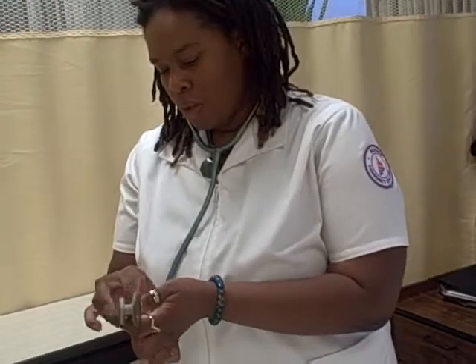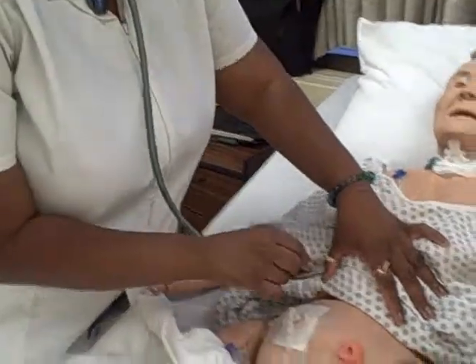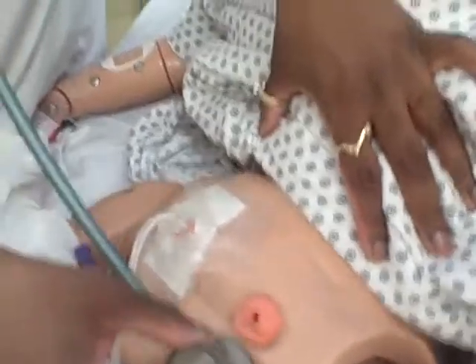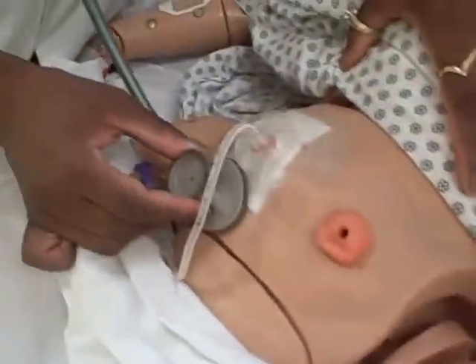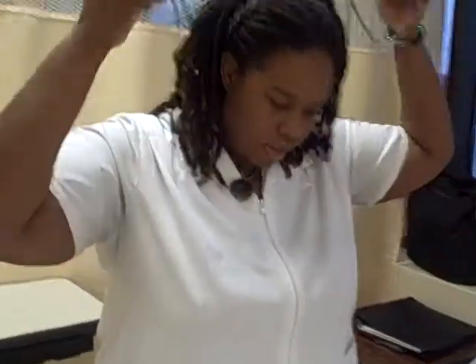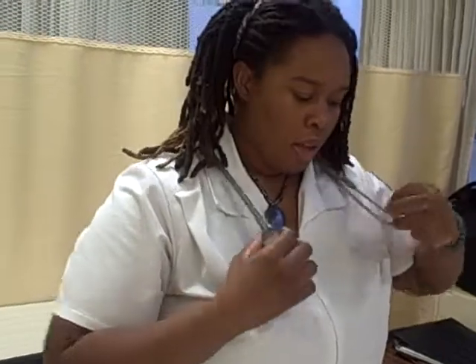So with an alcohol swab, I will clean the diaphragm and let it dry, and then auscultate the 4 quadrants. Okay, and from auscultation it is evident that there are bowel sounds present, and there seems to be peristalsis present in the abdomen. So I want to now gently palpate the 4 quadrants for any distension.